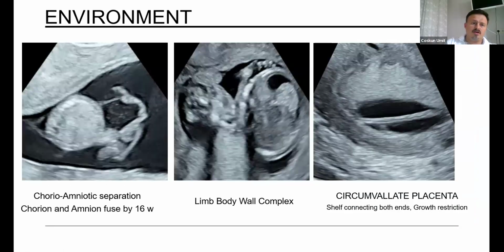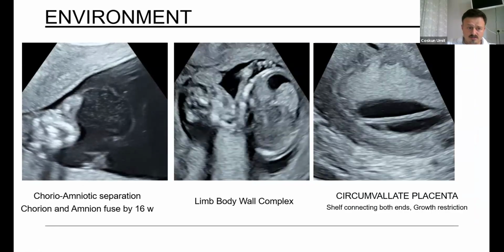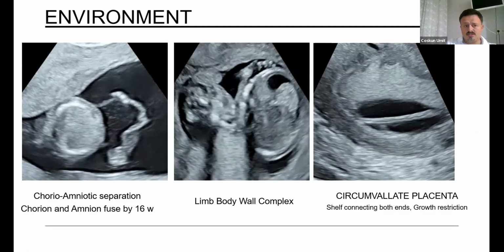And also, when we are checking the fetus, the environment is very important. Chorioamniotic separation is physiologic until 16 weeks, but after 16 weeks, it's a pathology. They should fuse by 16 weeks.